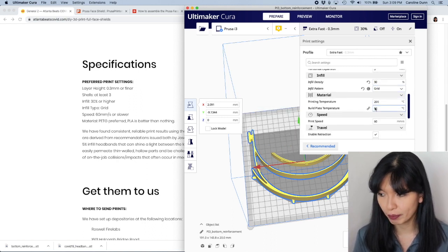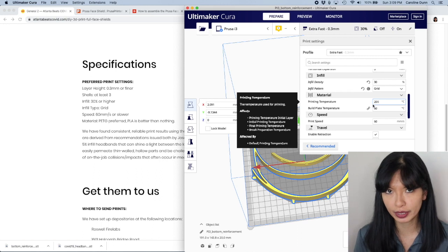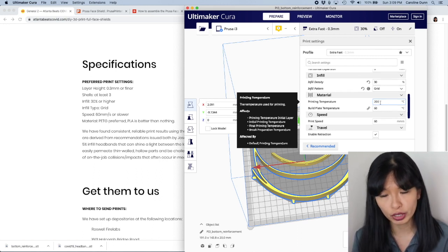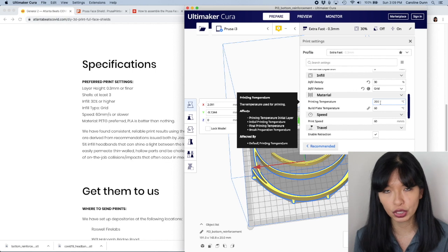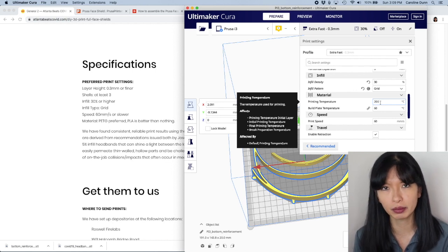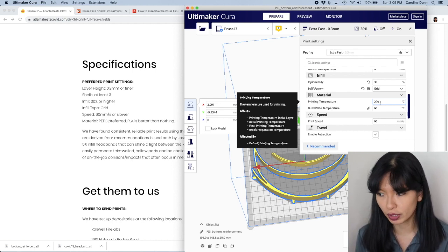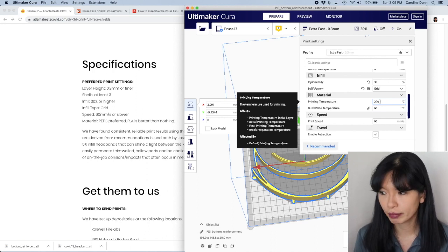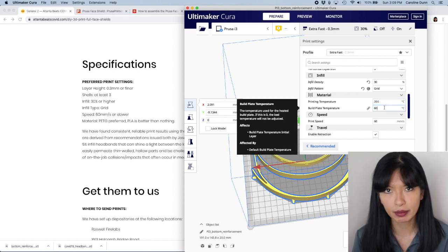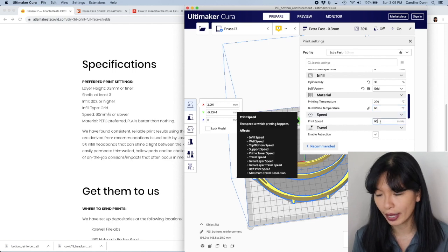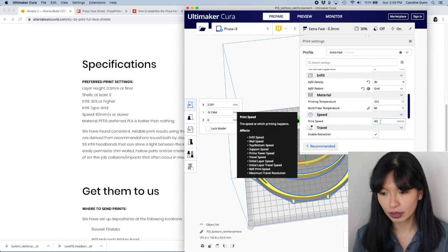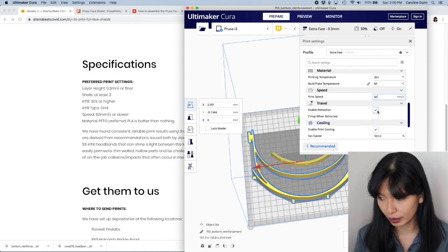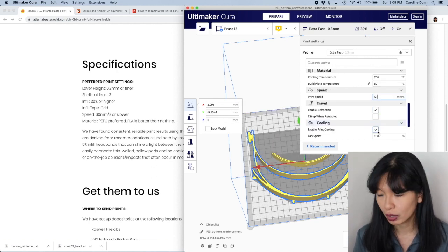Okay. And then let's talk about printing temperature. Now, if you're printing in PLA, a lot of that is done at 200 degrees. If you're printing in PETG, you're going to want to print a little bit higher. I believe that PETG prints around 240, 250 there. Make sure you've got your print temperature right. Make sure you've got your build plate temperature correct. You also want to have your print speed set to 60 or lower, according to that. And then you want to enable retraction as usual.